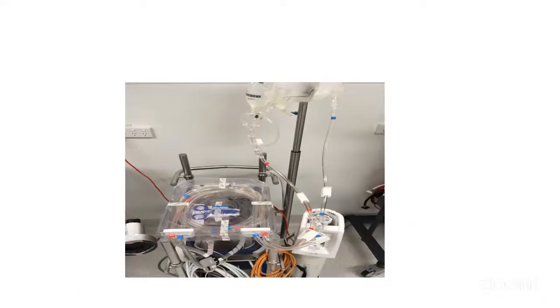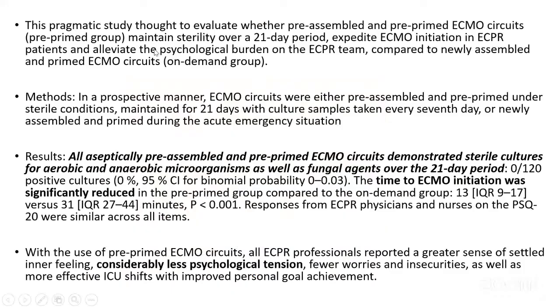So they tried to look at three or four things. They tried to maintain sterility over a 21 day period, expedite ECMO initiation in ECPR patients, and alleviate the psychological burden. They did multiple cultures. Every 7 days they sent a culture from this primed ECMO circuit, and out of 120 cultures, none was positive.